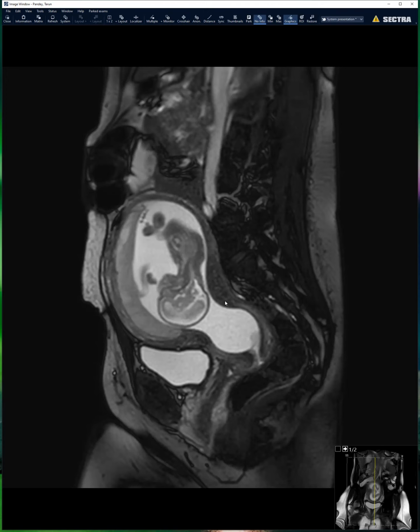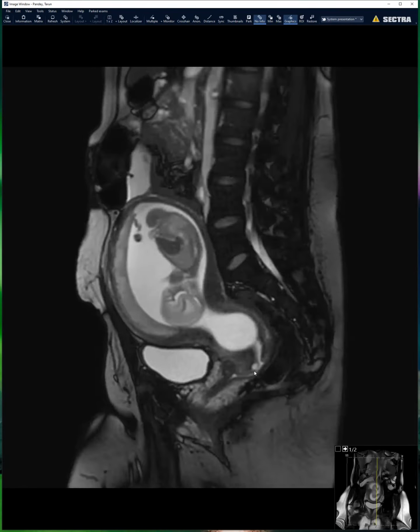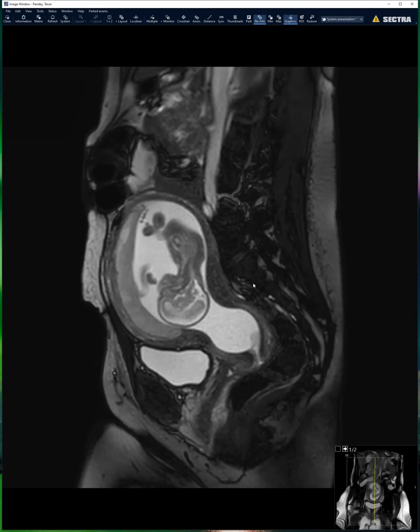we can look at this cervix. Sometimes you may think that this is a contraction, but we have to pay close attention to the overall length of the cervix and see how much of it has effaced. Because if there is vaginal bleeding and there is already effacement of the cervix which has started, then that is compatible with abortion in progress.